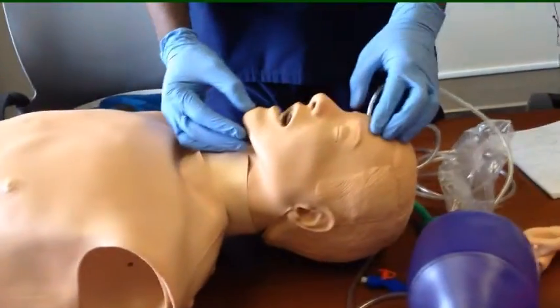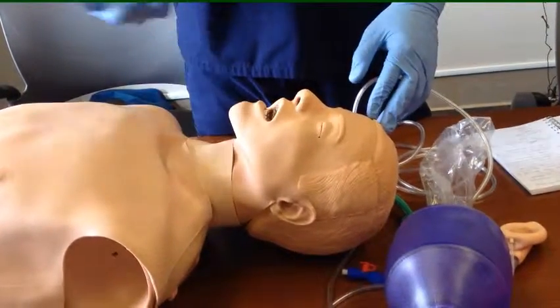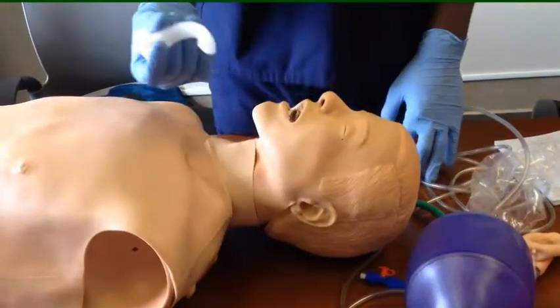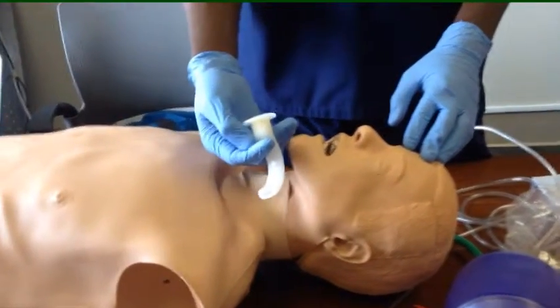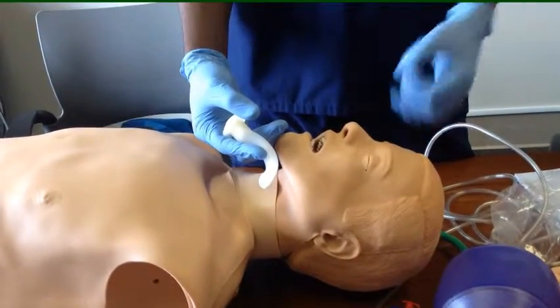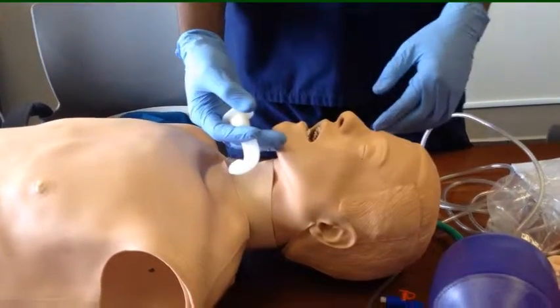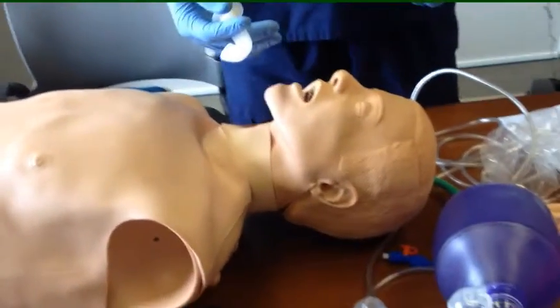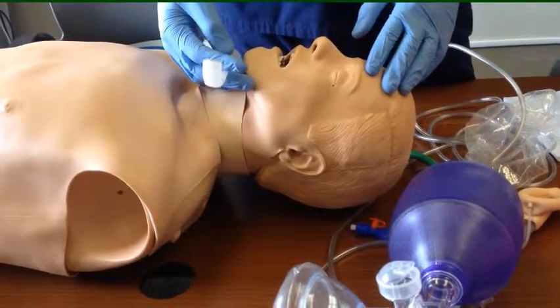Some of the things we have to remember is that we have to protect ourselves. We have to do hand hygiene. You must be wearing gloves. And as I mentioned before, sometimes, especially if you are using the OPA, oropharyngeal airway, the patient may end up vomiting. To protect yourself, you must put on a mask. You should also wear goggles. And definitely you must wear gloves, because you do not want to transmit whatever kind of dirt is on your hands to the patient, or get an infection from the patient.